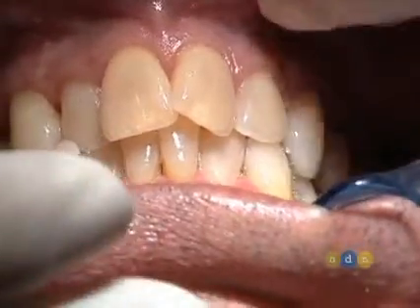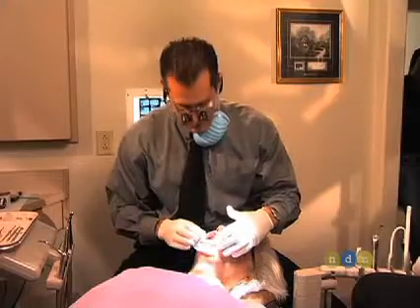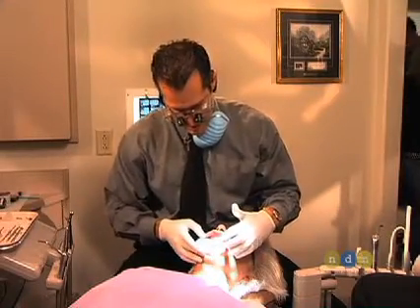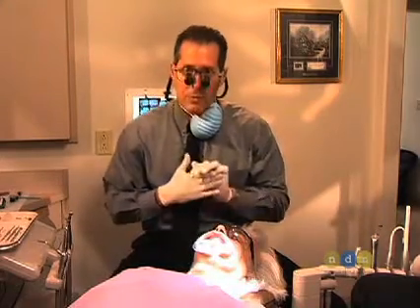This is the case. The gum tissue has already been altered by our periodontist. The periodontist is one of your key specialists you want to utilize when you're doing these types of cases. She's added some grafting to some recessed areas and we're going to go from there.